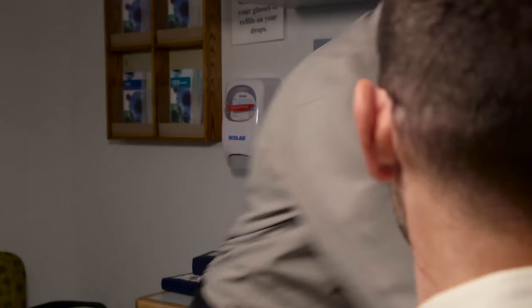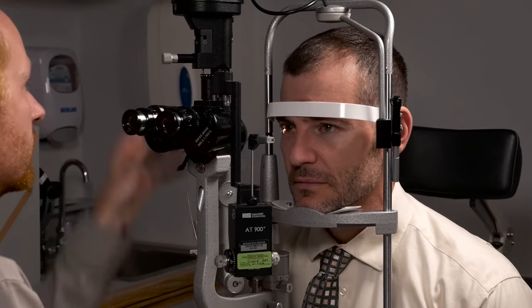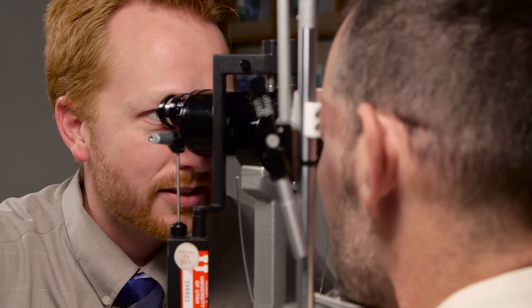When it's time to assess a GP lens, it's critically important that you use fluorescein. Fluorescein is really the only way to see how well the contact lens is moving, how much it's vaulting over the cornea, or if you have any problems such as a small amount of edge lift, SPK formed by the contact lens, or any other issues. I've got a small strip of fluorescein that I've already wet in some sterile saline. I'm going to have the patient look up toward the ceiling and put a little dot of fluorescein below his lower limbus on his conjunctiva. Then I have the patient blink for a few seconds, let it spread around, and then I assess the fluorescein pattern using the slit lamp with the cobalt filter.